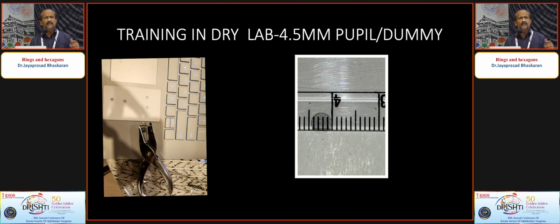Thank you so much. And you can punch out small elastic materials. That hole comes to about 4 mm on a scale. And you can use your B-Hex rings, and you can practice on this, a plastic ring, which you can stretch on a ring and keep, and you can practice. It helps a lot, do it whenever you want to go into rings.